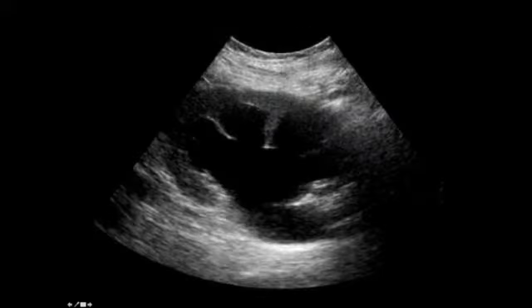And another example, we've got a thin cortex, and this time very much more marked distension of the calyces and collecting system, so that being a severe hydronephrosis.